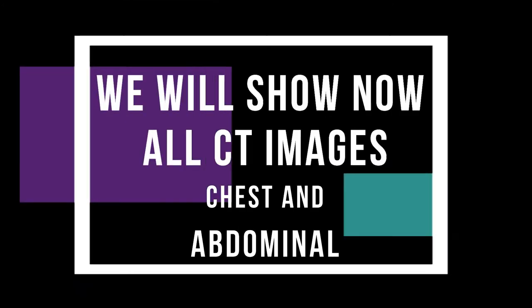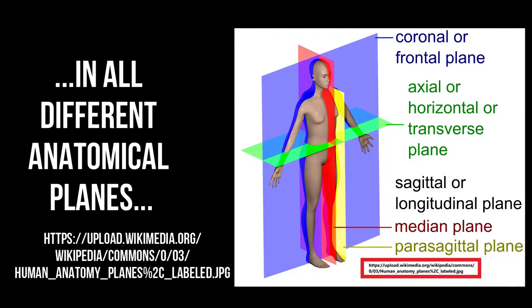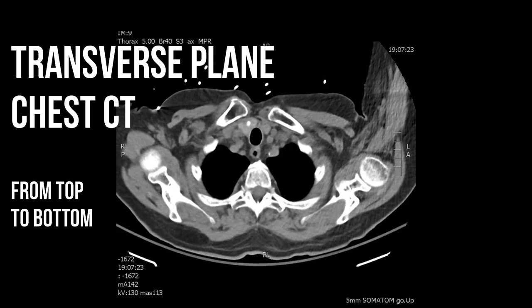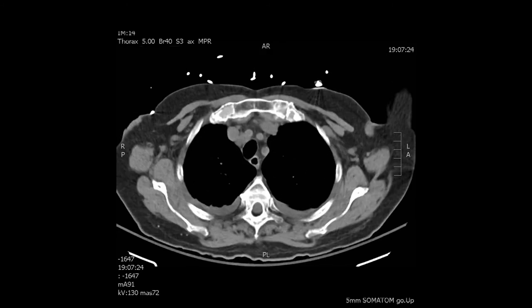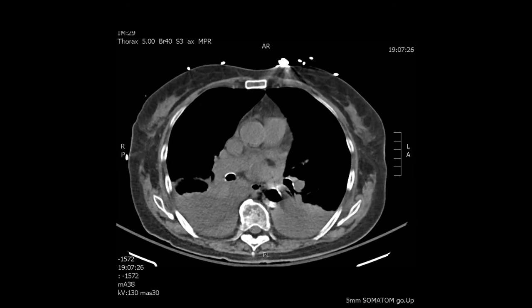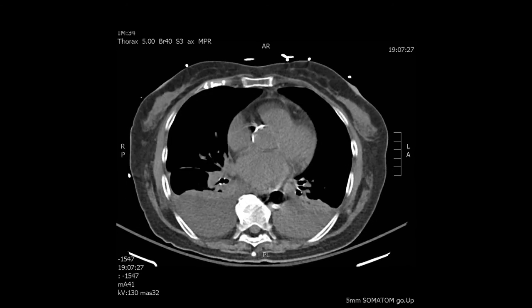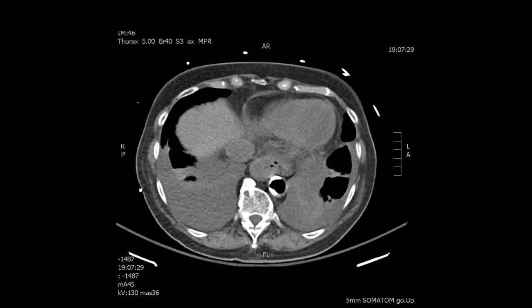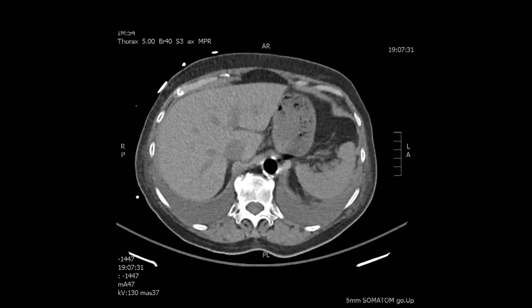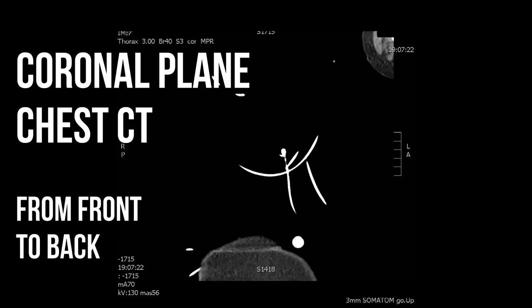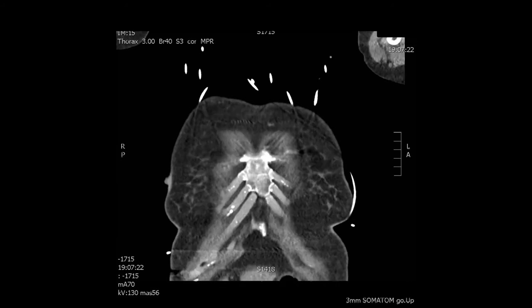We will now review all the chest and abdominal images in different anatomical planes — just to refresh the different planes. We'll see the transverse plane top to bottom again. It's interesting how this image can be quite puzzling if you are not aware the patient has a balloon pump inside, as you never see air inside the aorta. In this case it won't be air but helium, which is what the balloon pump is filled with while in action.